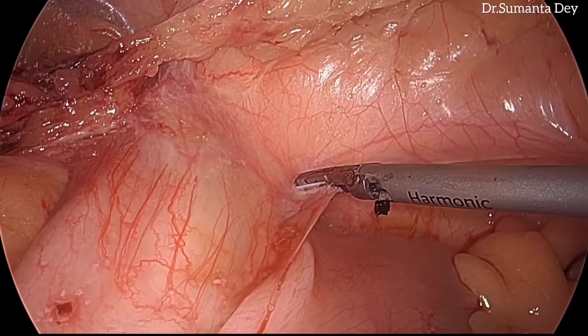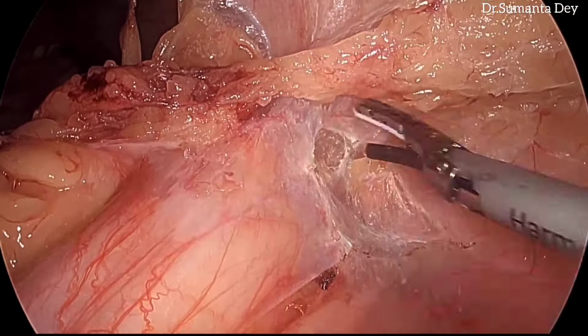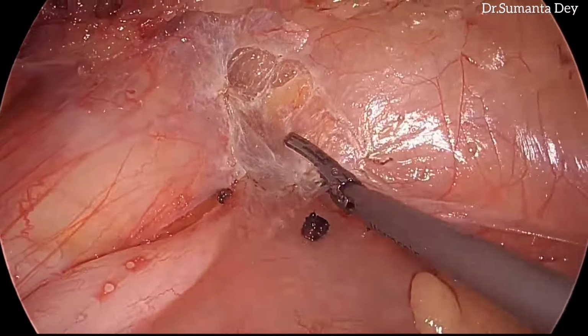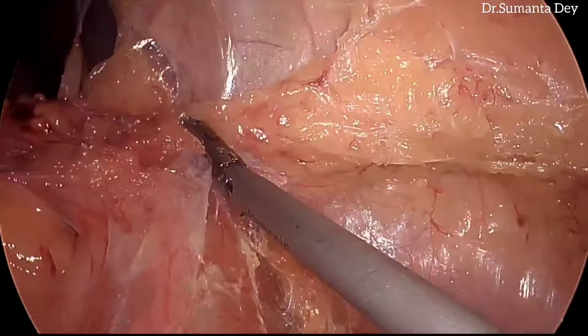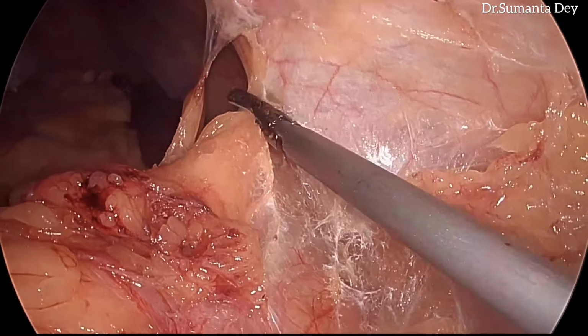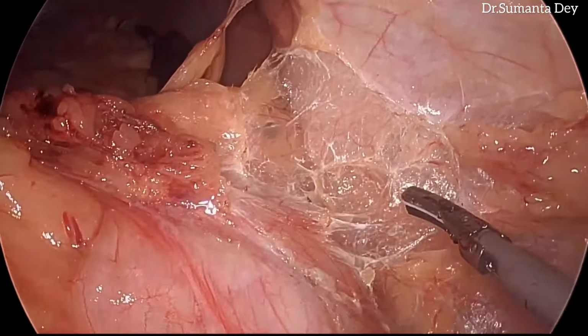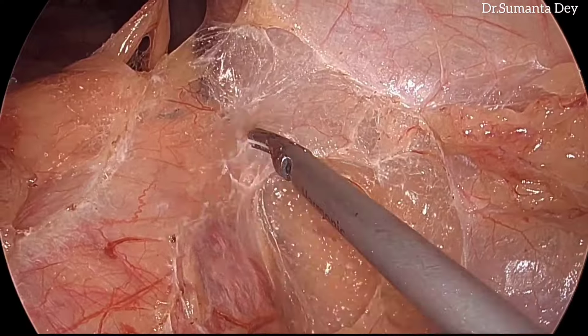So, supracolic and lateral dissection. First of all, the left colon is being mobilized laterally now. You can see, using harmonic shears, I am pulling the left colon with my left hand, and then I will dissect up to the plane that I have created from the medial to lateral dissection. I should connect both the planes.